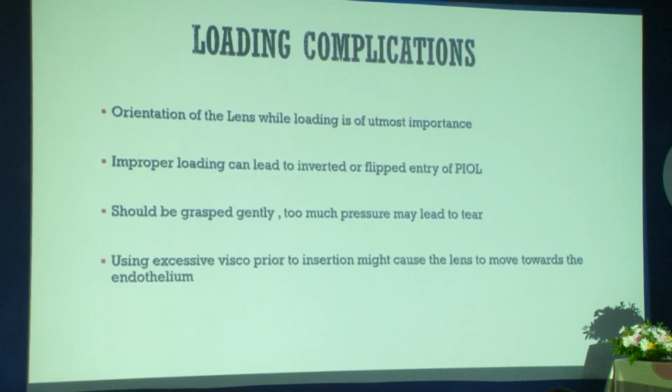These are all very important, because how your IPCL or ICL or phakic IOL behaves in the anterior chamber depends totally on the ease and orientation of insertion. While loading the lens, be careful not to grasp it too tightly, or from the edges, because these are very sensitive edges. You might just end up ripping them, especially for the ICL.